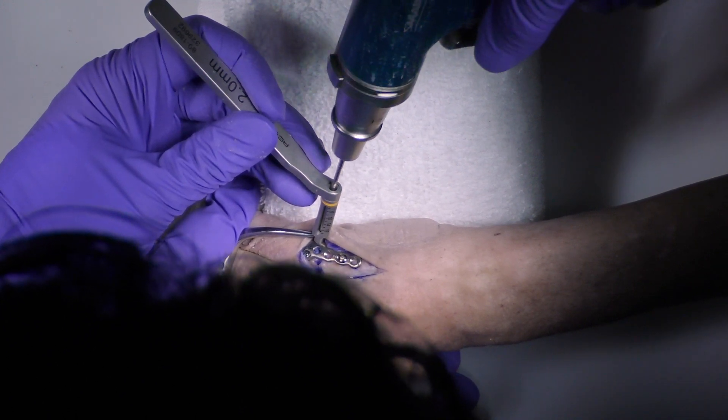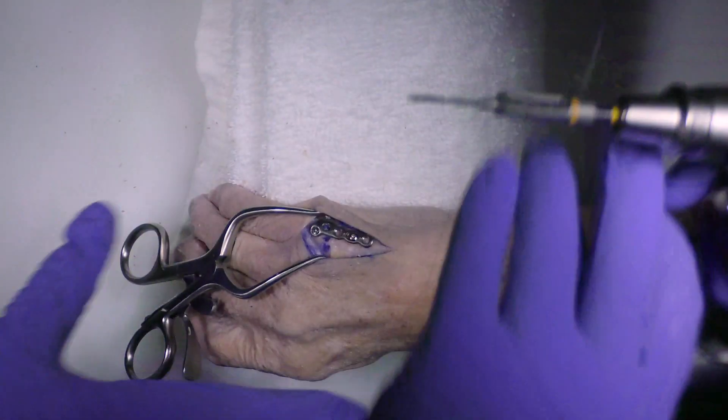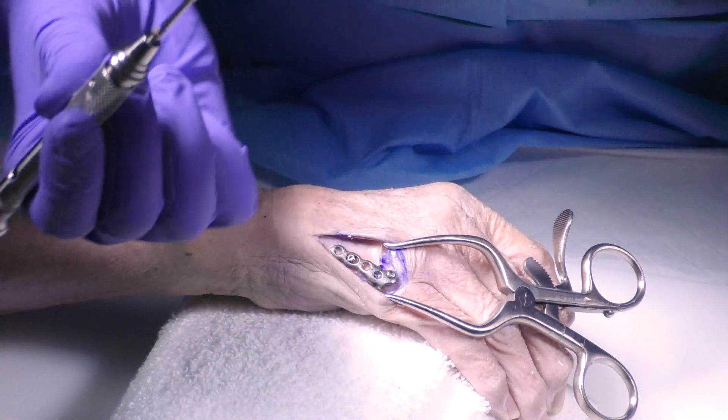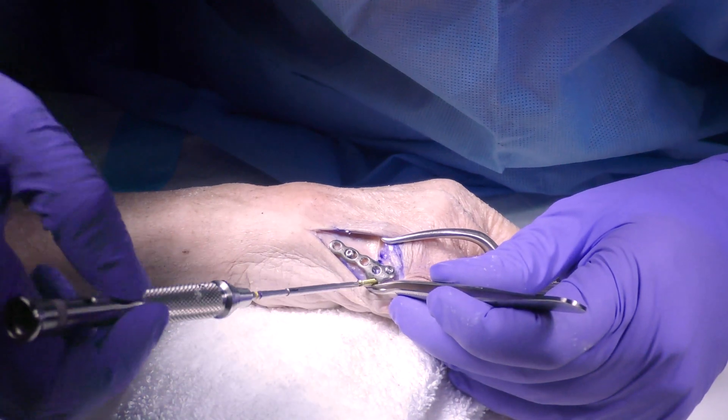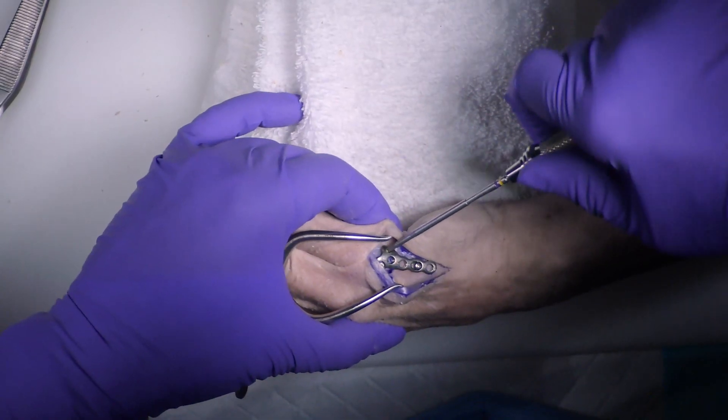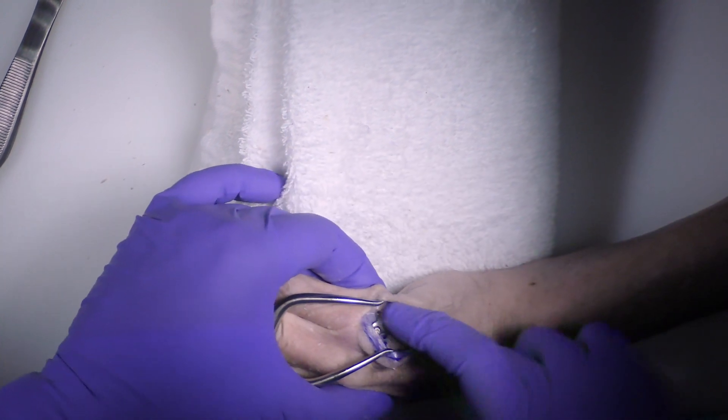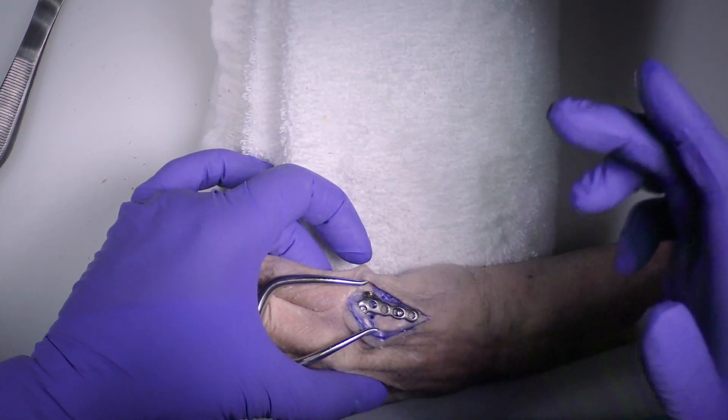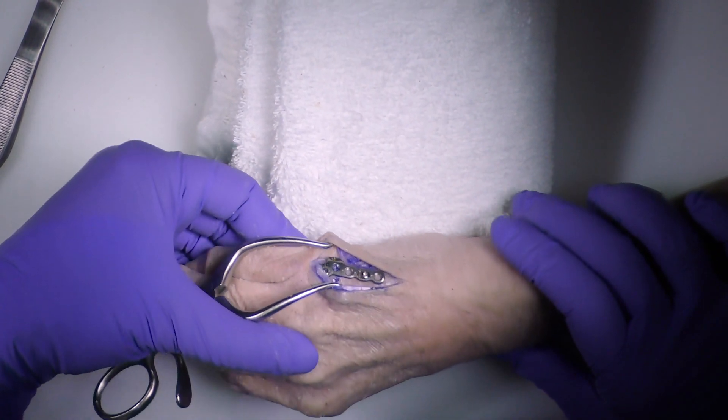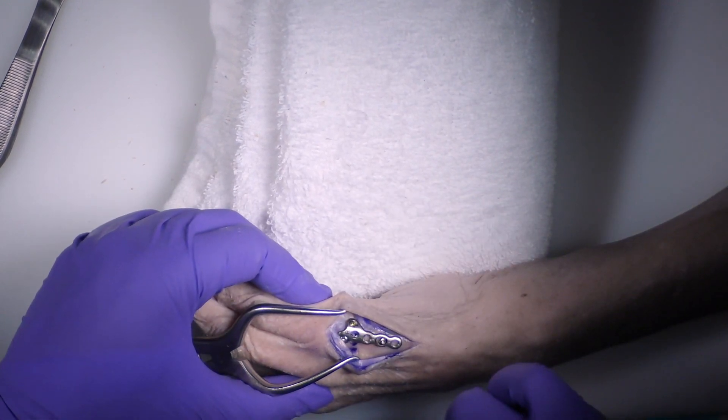So these are calibrators. I can stop there. I'm measuring a 12 when I hit the second cortex. This seems about right to me, so I'm going to stop. I'll take a 12 locking screw, please. And always locking screw, great bite and zero profile. So if I put my finger over top of it with variable angles, sometimes there can be a little bit of prominence because there is a 20 degree or 15 to 20 degree arc of angulation.